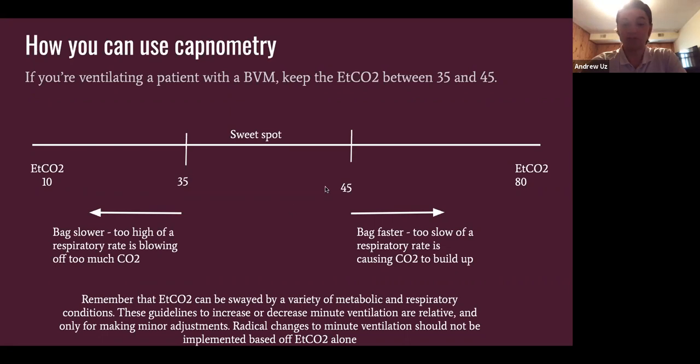So if you're bagging somebody and everything's good, you're hanging out at an end tidal CO2 of 40, no need to change anything. But if maybe you're bagging them every 6 seconds and CO2 is up to 50 or 55, maybe bag them every 5 seconds.